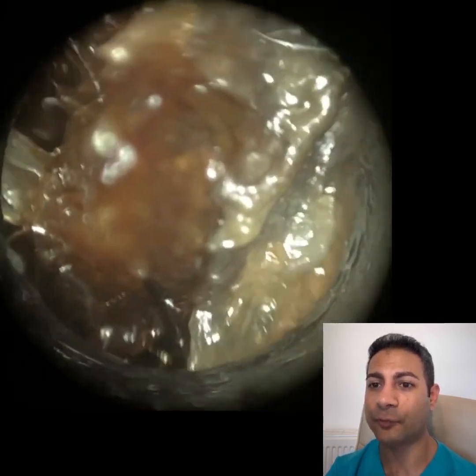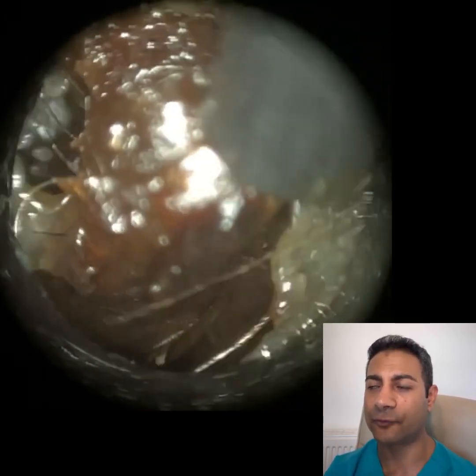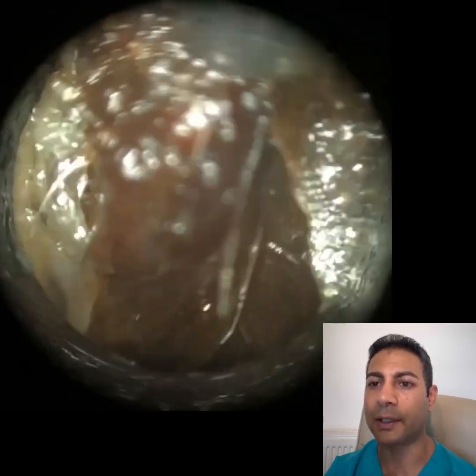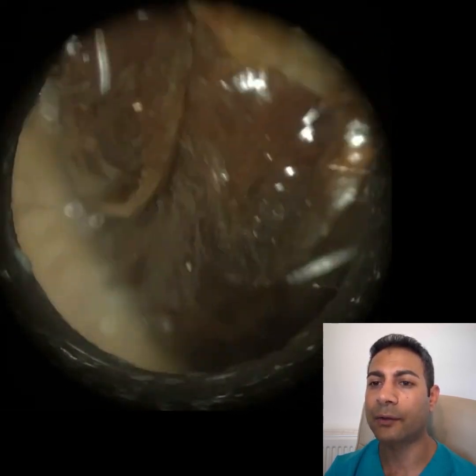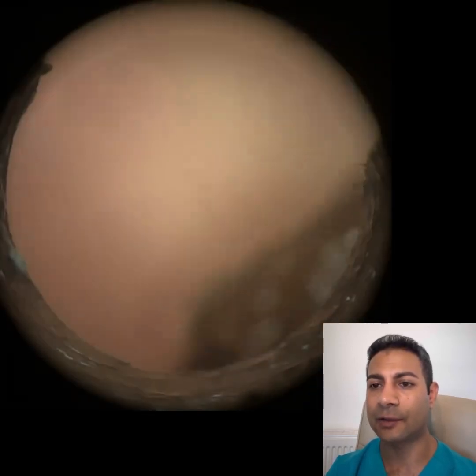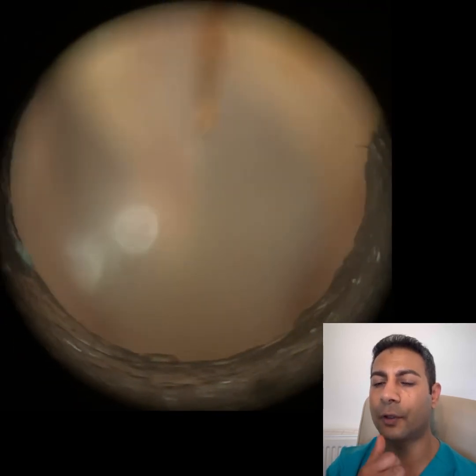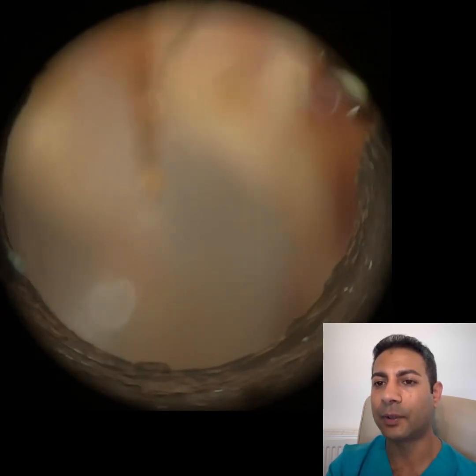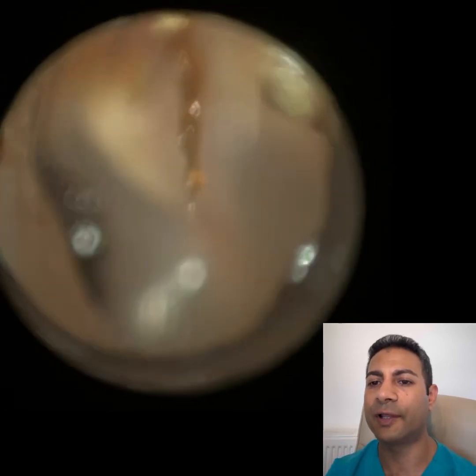Now, is it possible for a wax plug to measure that length? In theory, no, unless someone's got an abnormally long ear canal. So the average human ear canal length, an adult, is about 2.6 centimeters. But because there's a lot of dead skin content, the dead skin kind of folds upon itself, it coils over itself. So when you remove the wax and keratin plug, the skin unravels, hence why it's a lot longer than the average length of the canal.